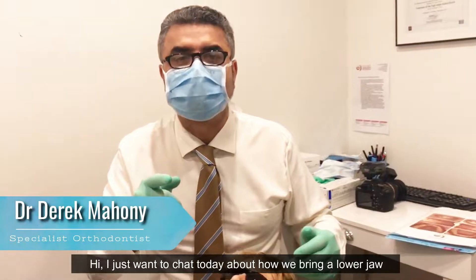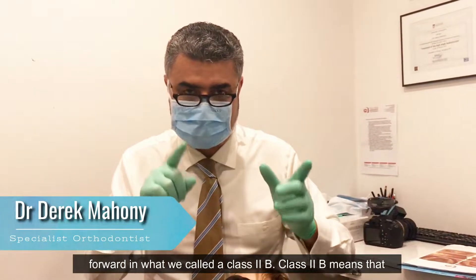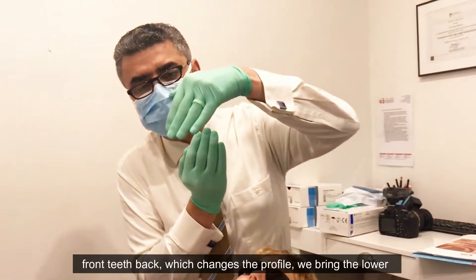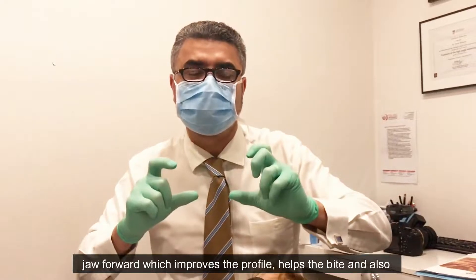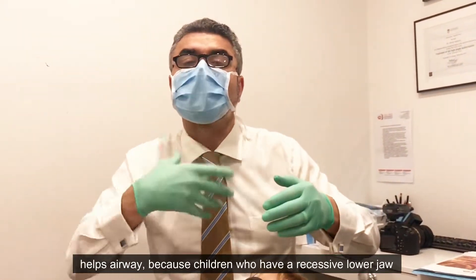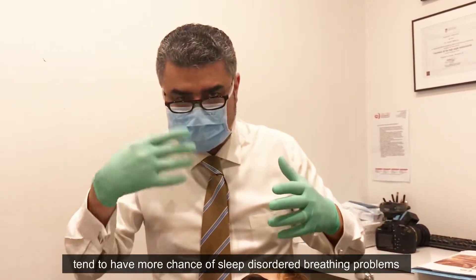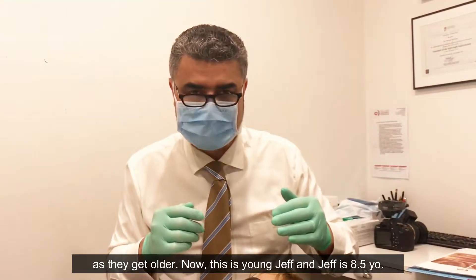I just wanted to chat today about how we bring a lower jaw forward in what we call a Class 2 bite. Class 2 bite means that the lower jaw is behind the upper jaw, and rather than pull front teeth back — which changes the profile — we bring the lower jaw forward, which improves the profile, helps the bite, and also helps the airway, because children who have a recessive lower jaw tend to have more chance of sleep disorder breathing problems as they get older.